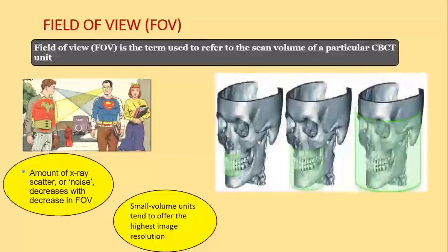So we have people who refer, probably now with the new Vi-Scan that you have in Shivamogga, you will have patients coming with prescriptions. I would still prefer practitioners saying, hey, I want this area, rather than telling me I want a small FOV because it's priced cheaper. You should not say, I want medium FOV because it's cheaper than something else, or I want a small FOV because it's cheaper than a large FOV.